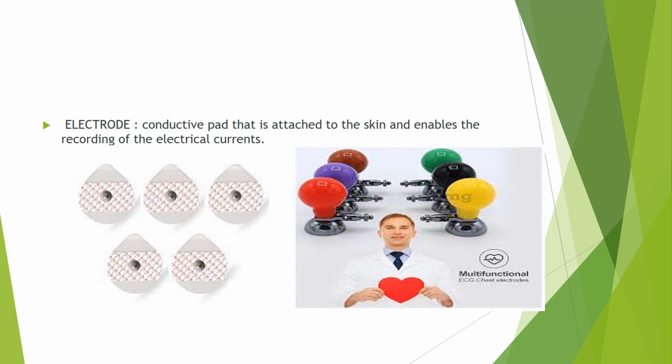Next, we can see the difference between the ECG electrode and the ECG lead. An ECG electrode is a conductive pad which is attached to the skin and enables a recording of the electrical currents. So an ECG electrode is a conductive pad attached to the skin to record electrical activity. This picture shows the chest electrodes.